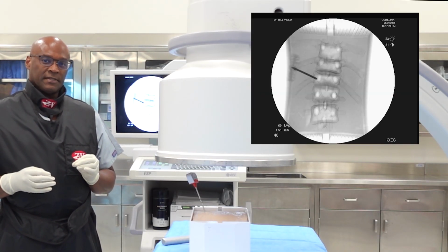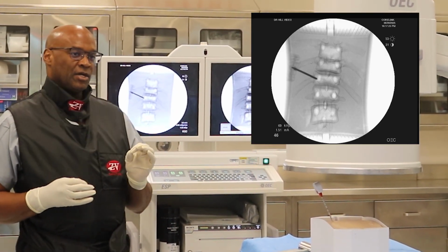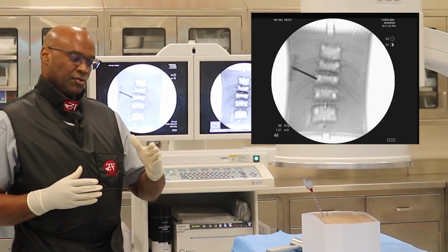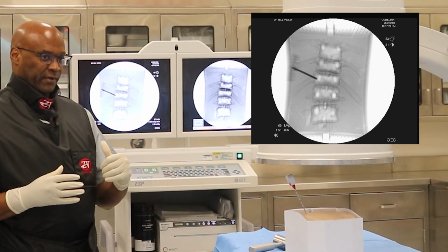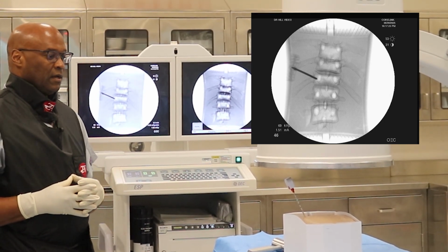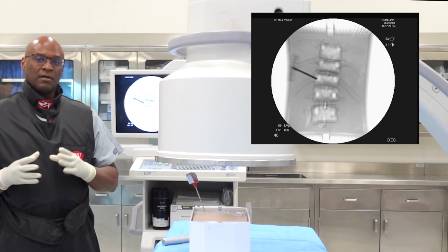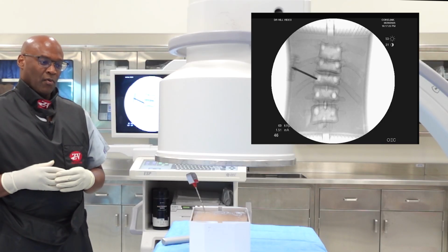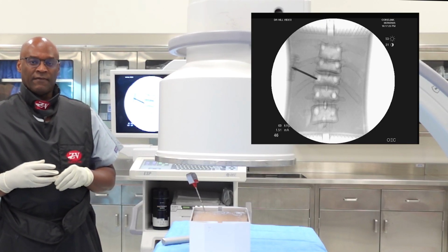Our objective is to stay in the safe zone. What we're trying to achieve is to keep the Jamshidi needle within the pedicle and not traverse too medially that we wind up in the canal space, not to go too inferior where we can go into the foramen. So we will do a series of AP and lateral x-rays to maintain our trajectory. So this is our first entry point into the pedicle. Now we're going to go to a lateral position and evaluate our trajectory.